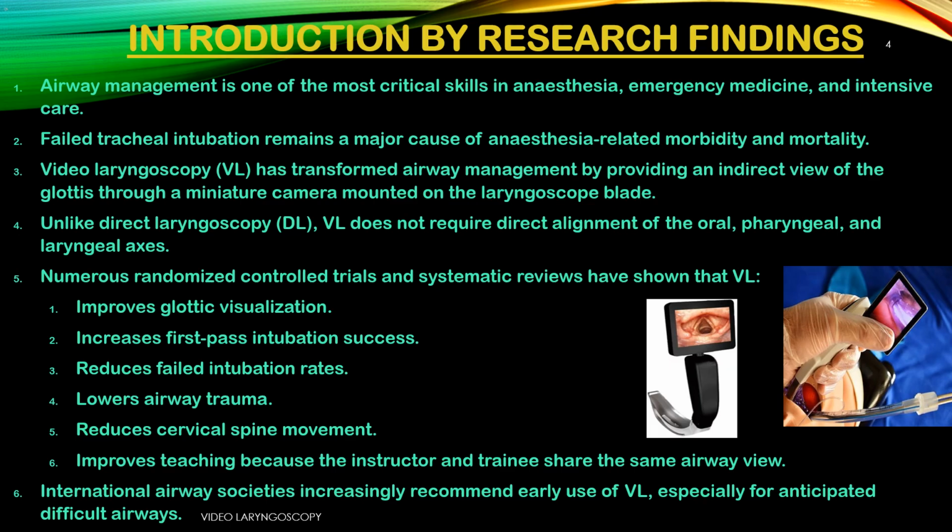5. Numerous randomized controlled trials and systematic reviews show that VL: 1. Improves glottic visualization. 2. Increases first pass intubation success. 3. Reduces failed intubation rates. 4. Lowers airway trauma. 5. Reduces cervical spine movement. 6. Improves teaching because the instructor and trainee share the same airway view.